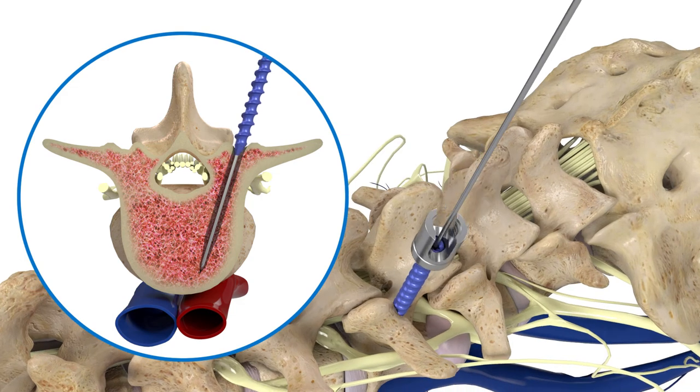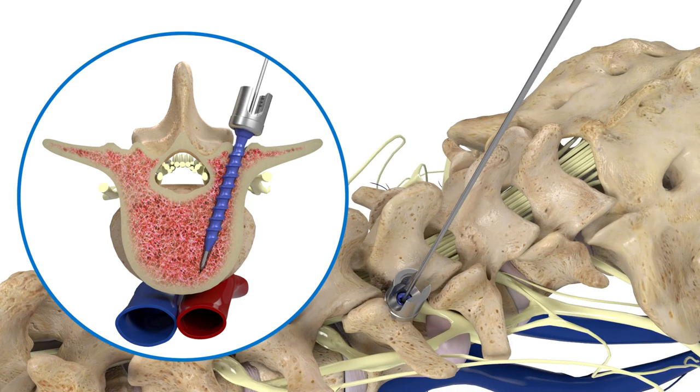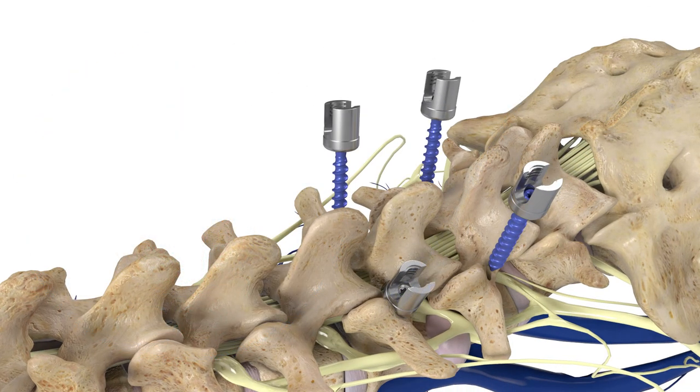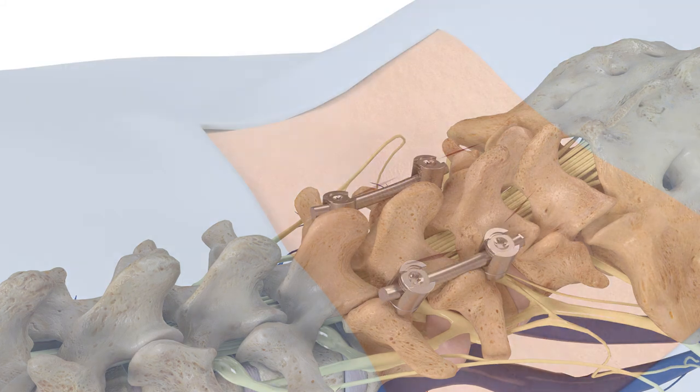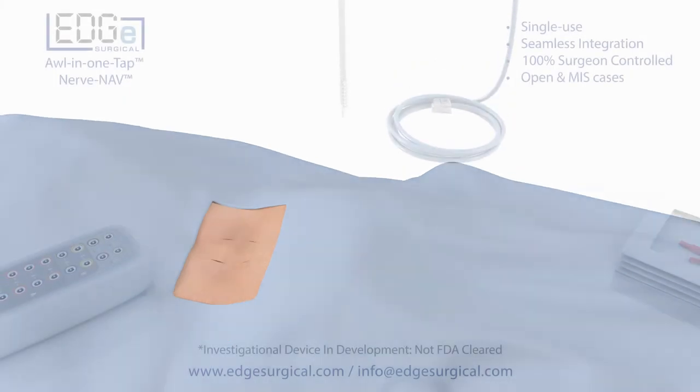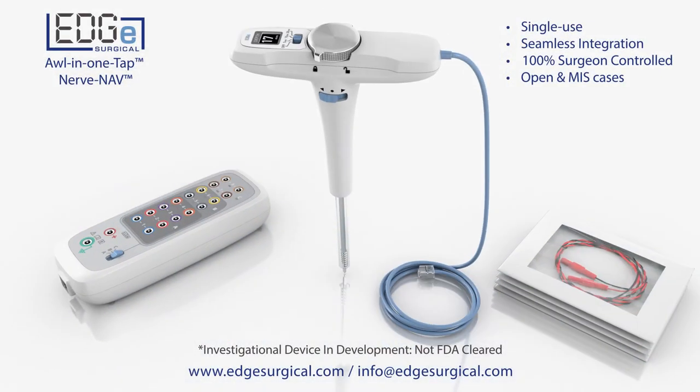A screw is then inserted and the process is repeated until all pedicle screws are properly placed. The all-in-one tap combines several features, providing a safer tool when placing spinal pedicle screws and minimizes the number of surgical steps required.